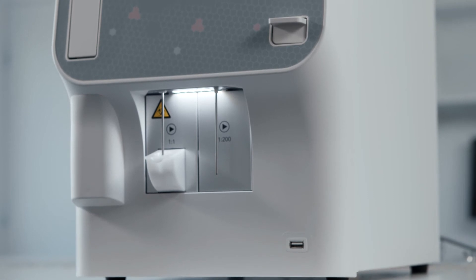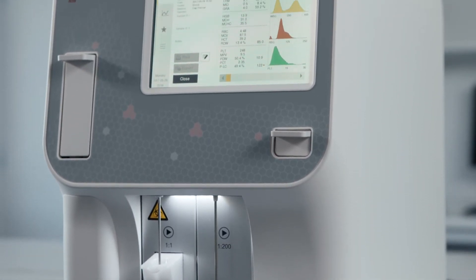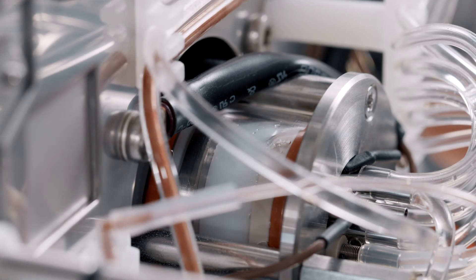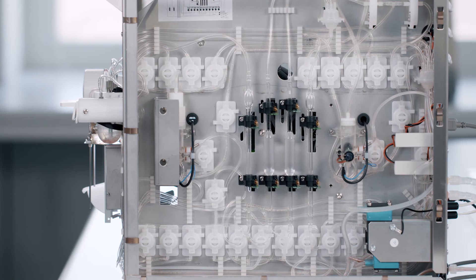It's both simple and accurate, just like the rest of SphereLab Alpha Plus. SphereLab Alpha Plus requires virtually no maintenance — its high precision shear valve is completely maintenance-free and carries a full three-year component warranty.